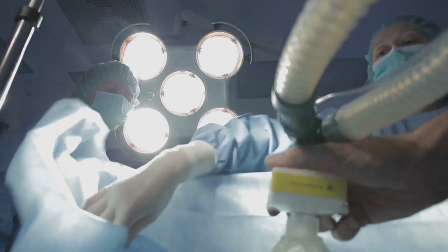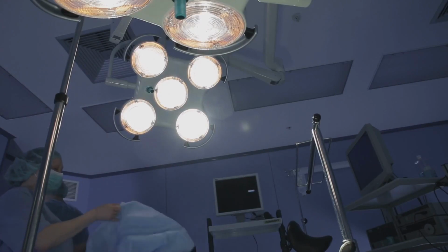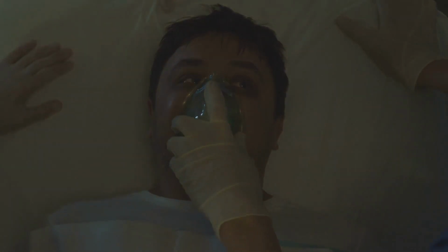So, why is topicalization important? The goal is to numb the airway. This reduces discomfort and gagging during the procedure. In essence, it makes the process smoother and more comfortable for the patient. Let's break it down into some simple, manageable steps.